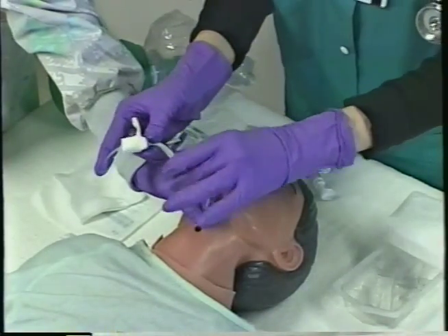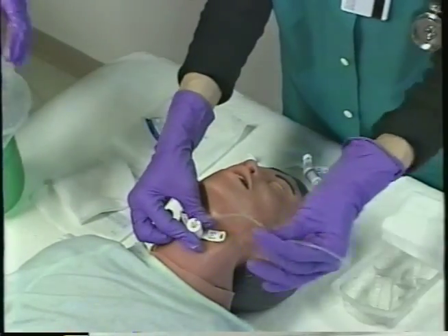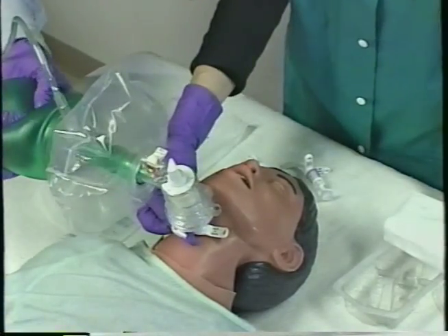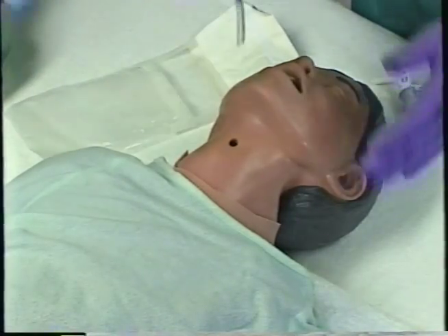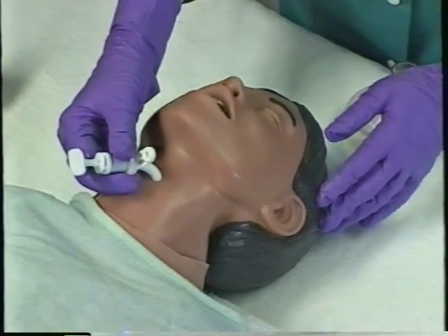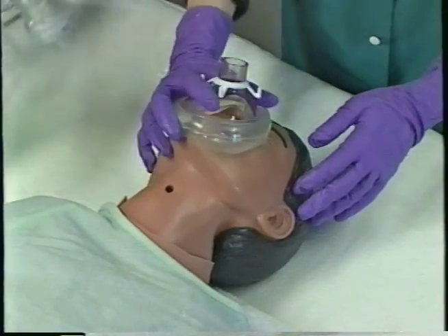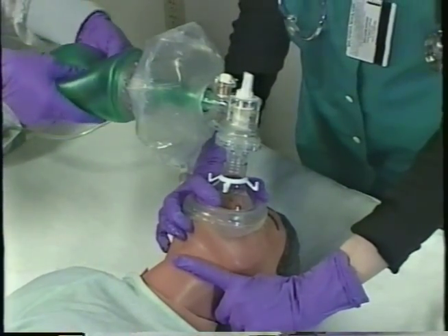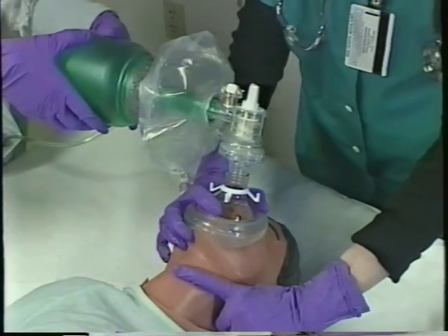Sometimes a suction catheter, with the thumb controller removed, may be placed through the stoma and into the trachea. The tracheostomy tube is then threaded over the suction catheter, which acts as a guide. Standard endotracheal tubes may be substituted for tracheostomy tubes if needed. If a tracheostomy tube cannot be inserted through the stoma, consider oral tracheal intubation. Often, one can provide adequate oxygenation and ventilation using standard bag mask ventilation while occluding the tracheal stoma site to avoid air leak.